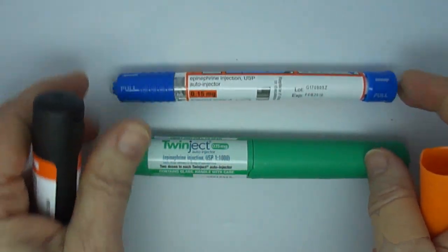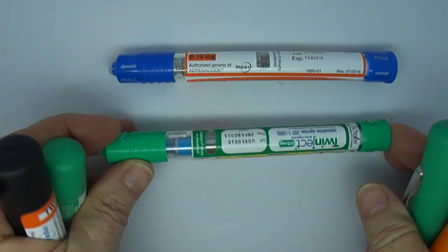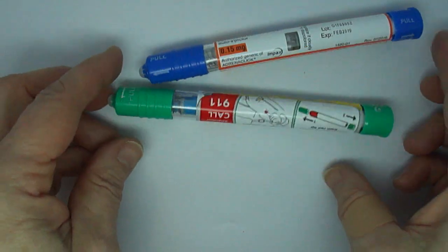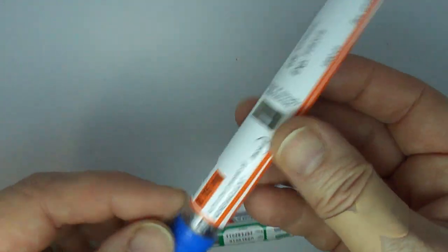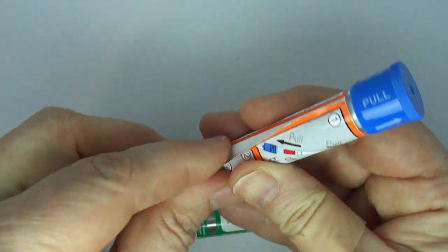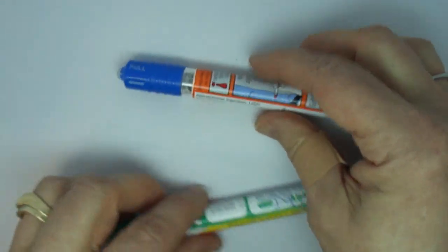you can see that these two devices actually, on the surface of it, look really quite similar. Similar shape. They both have two caps, they have a similar label, and actually the label opens up in a very similar way to reveal extra information underneath.